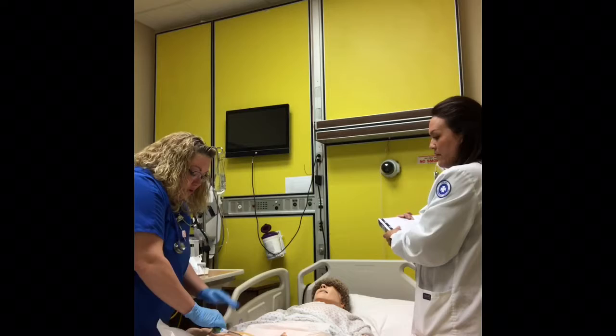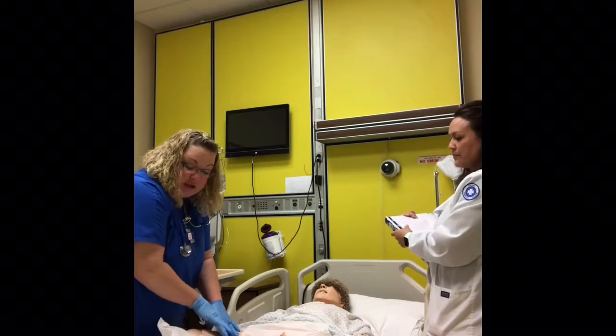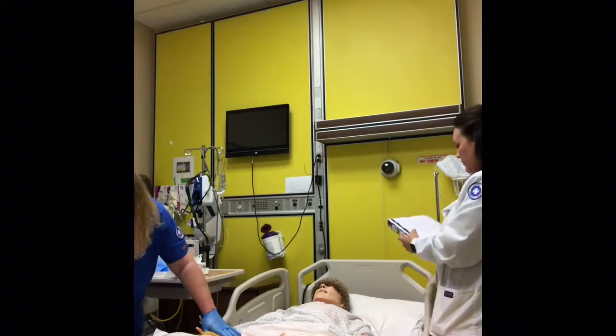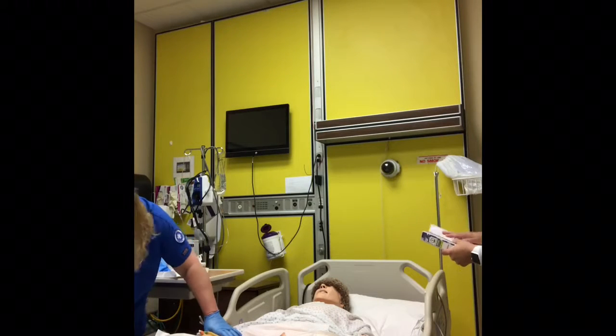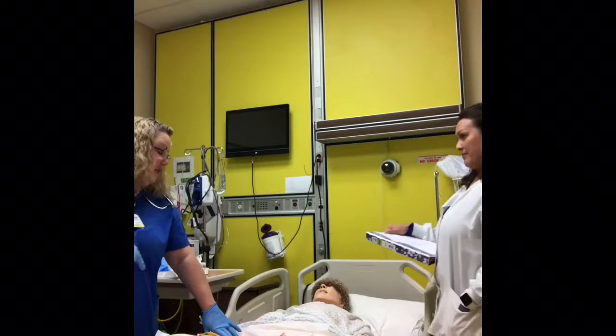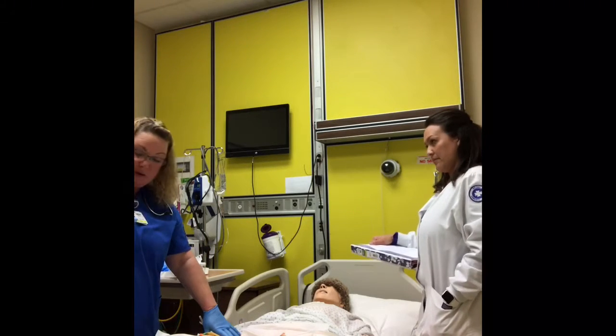Okay, so now I'm going to secure the line to the patient's leg. We're going to hang the bag, oh, not like that. We're going to hang the bag down below, but not on the side rail because it'll go up and down. And then make sure the patient's comfortable, and I can go ahead and get rid of all my debris.